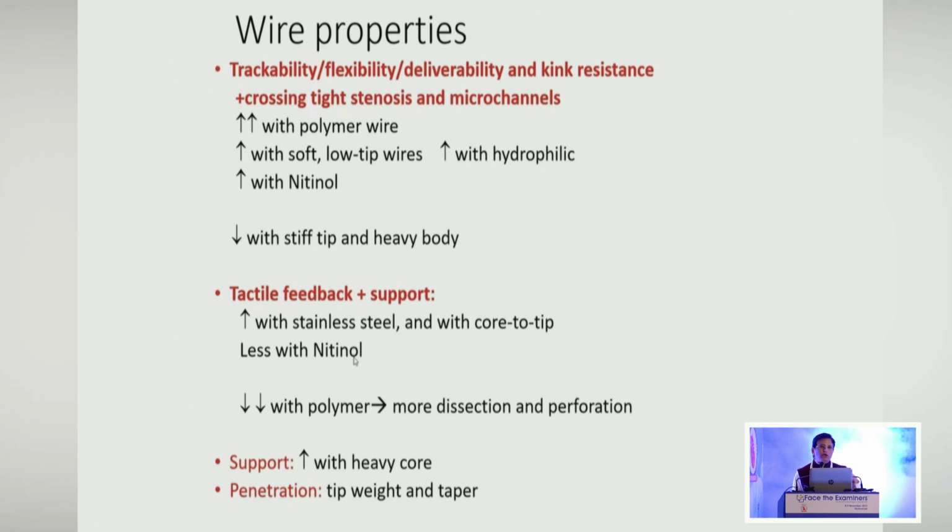So it really has to depend on the type of lesion which you are to cross. And according to that, these are the wire properties you should keep in mind, and then you should select your wire.